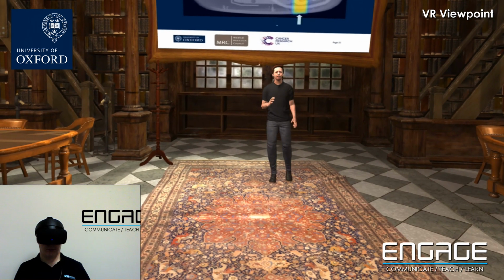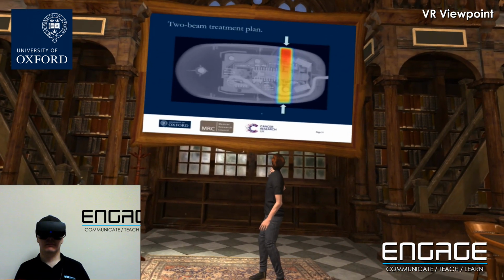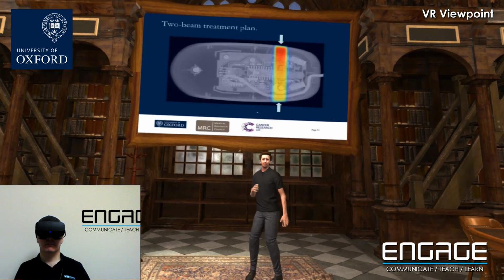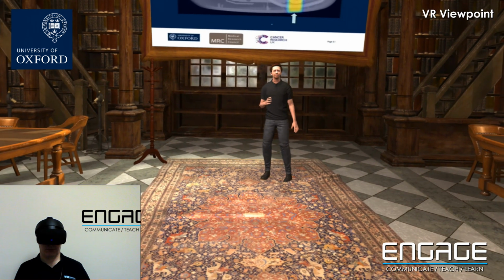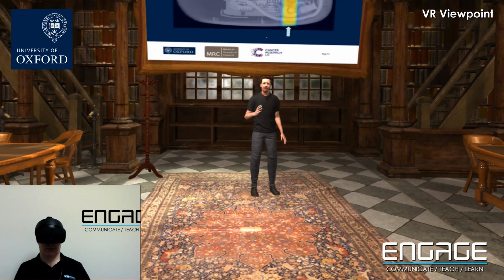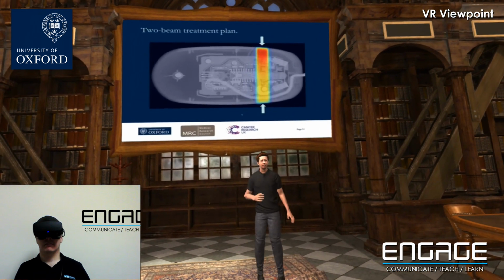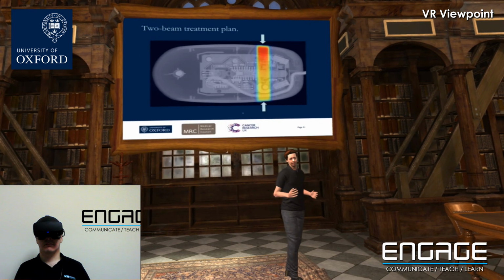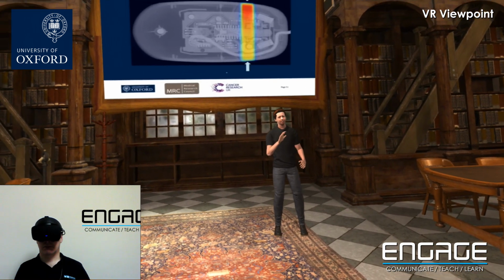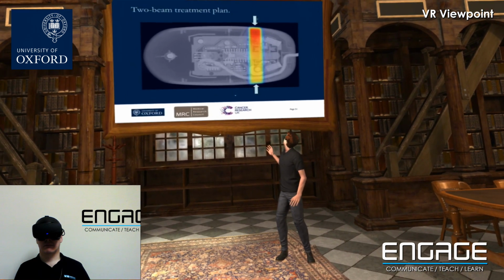Let's introduce a second beam from the bottom. Two things to remember here. One, the beams are not uniform. Remember, most of the damage is done right at the start. So most of the damage from this beam is done at the start here. Most of the damage of this beam is done at the start here. The two beams travel through the same bit of the mouse, but the two beams are not the same intensity. The number of cannonballs being fired per second is different. So this beam is much more intense than this beam.